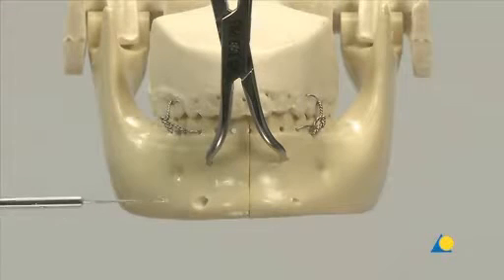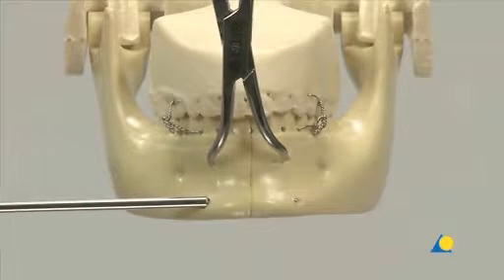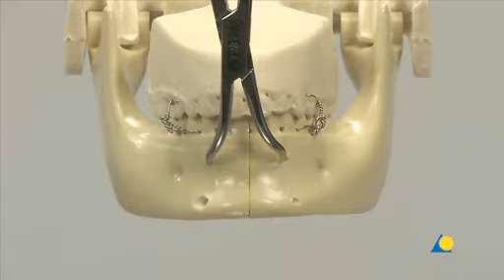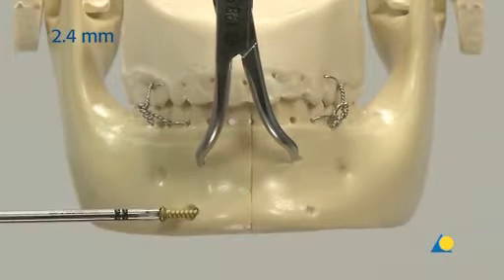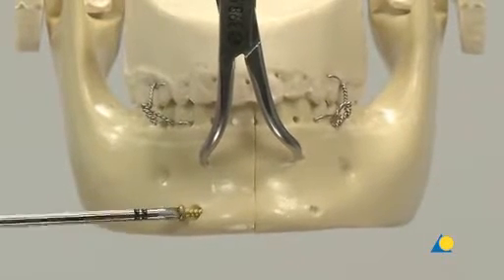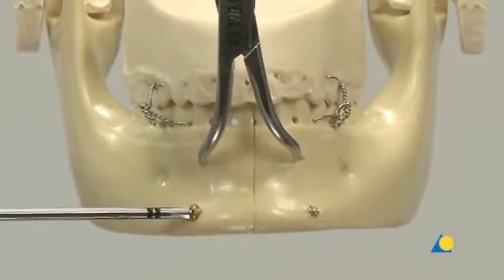The screw length is determined with the depth gauge. When using the lag screw technique, 2mm are added to the measurement to ensure that the far cortex will be fully engaged by the screw thread. In this exercise, the bone is not tapped; however, some surgeons feel that tapping is indicated in dense symphysial bone. The 2.4mm screw glides through the near hole while engaging in the far fragment, and compression is achieved as the screw head engages the countersunk portion of the near fragment.